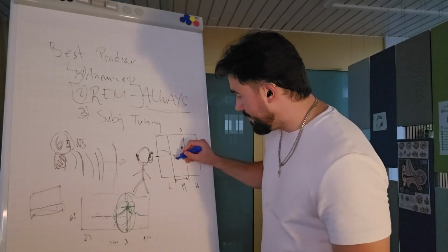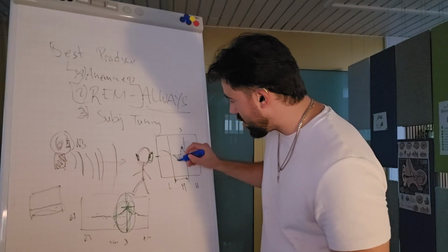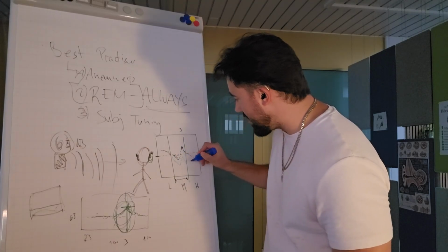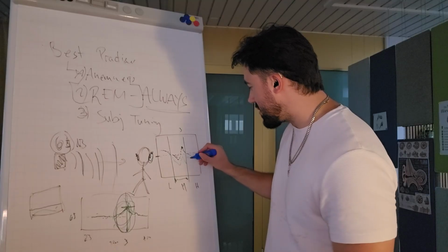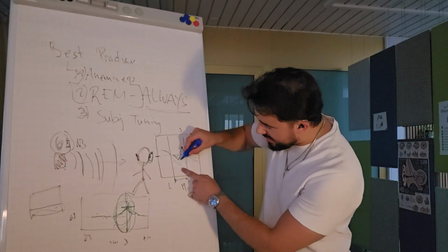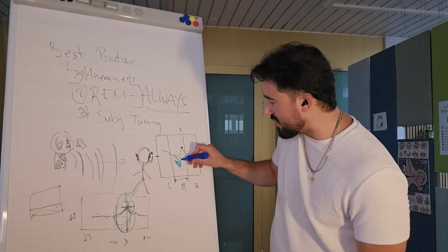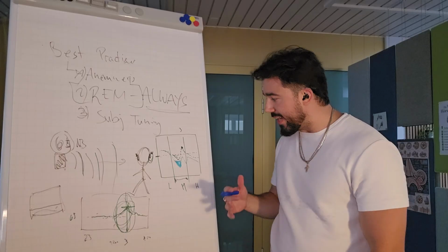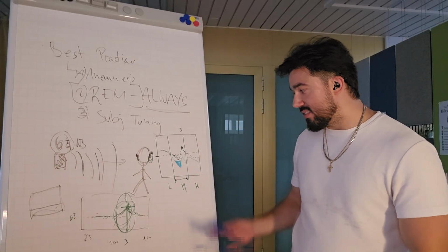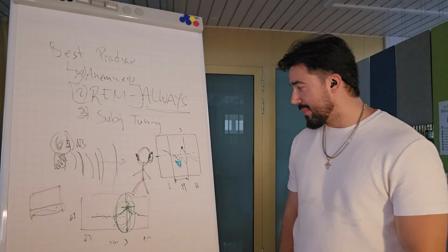But anyway, maybe you do, and then what's gonna happen is it goes lower here, and you just have this thing down there. So now some frequencies are even more quiet, while this other one is less painful now, of course, great, but still, this is not good sound quality, right?